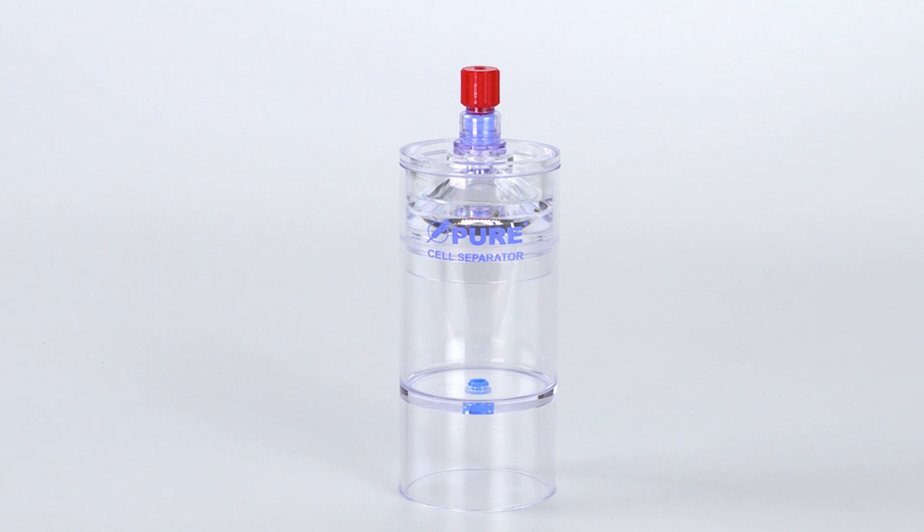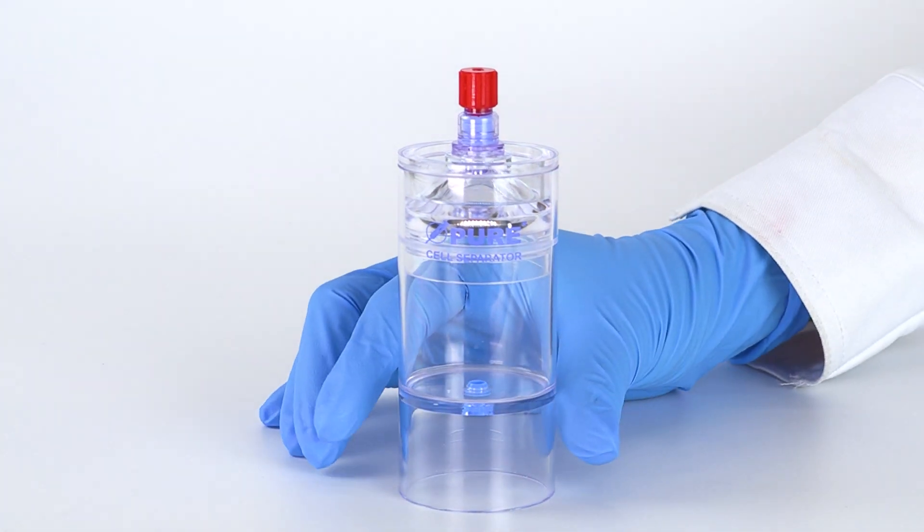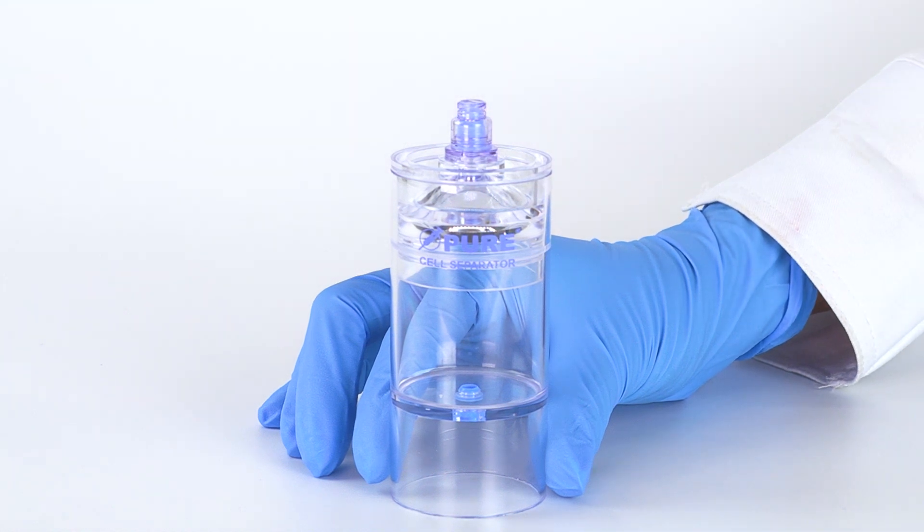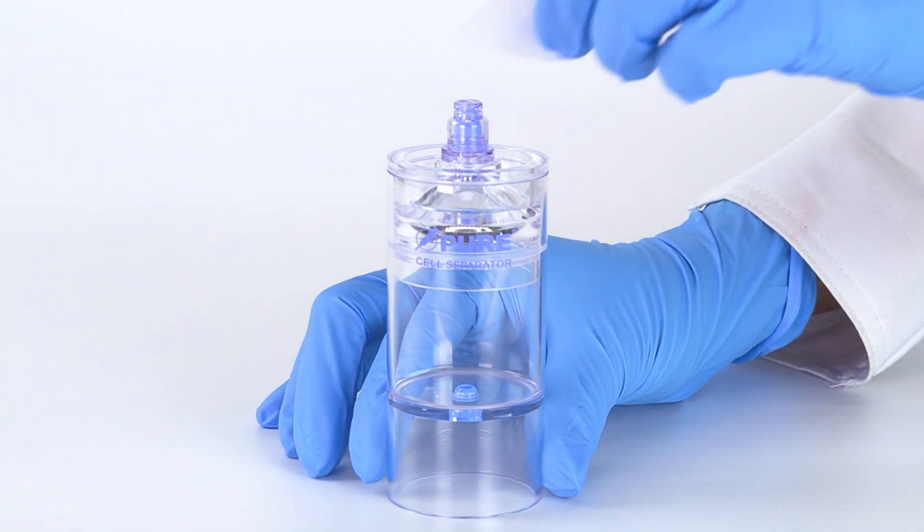To begin, remove the red cap from the needleless valve port of the separator device. Swab the port with sterile alcohol before and after accessing with a sterile syringe or cap.